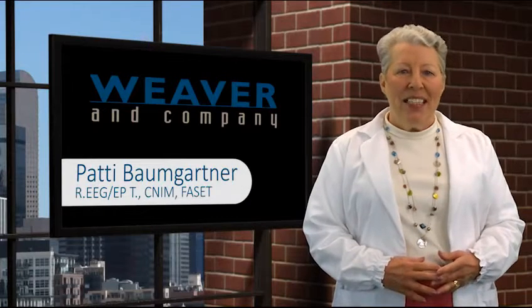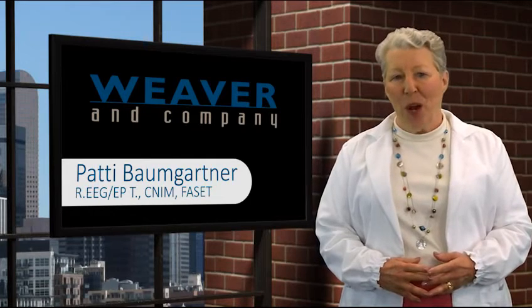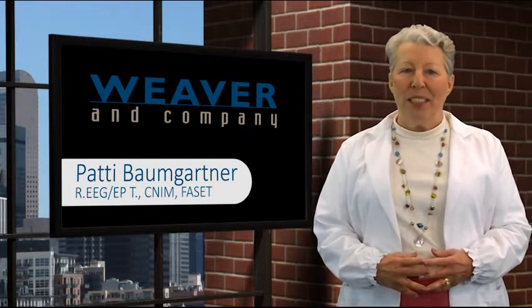Hi, I'm Patti Baumgartner. Today I'm going to show you how to apply EEG electrodes using Weaver products, 1020 conductive paste, and Nu Prep Skin Prep Gel.